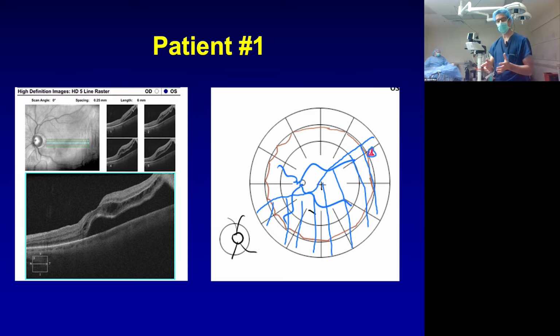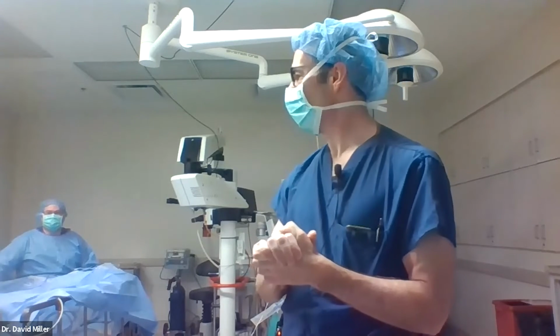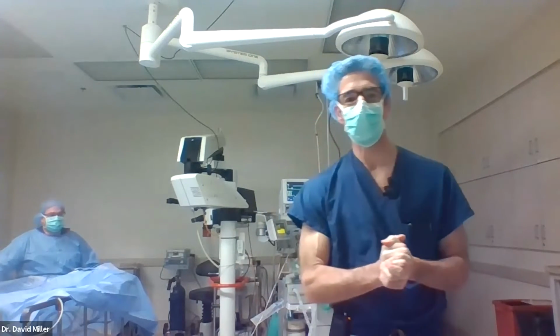We'll start the case. As any surgery takes, and retinal surgery is certainly no exception, you have to have a team of people with you to perform these cases adequately. So my team here is Julia, my circulating nurse, and Kim, my surgical assistant. Angelica is my anesthetist, and Tennessee Mike is my surgical assistant again. So we'll get it going, and I'll talk through the case, and we can take some questions too.